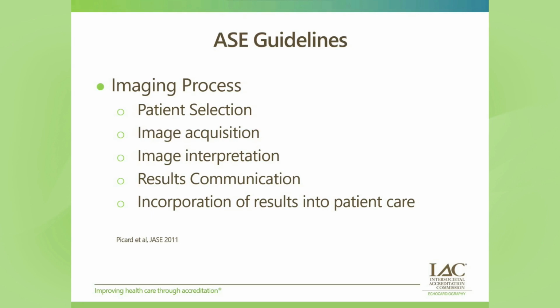Stat or urgent studies should be interpreted and communicated immediately. Routine studies should be interpreted within 1 business day. So each Echo Lab should have a policy for reporting critical values and a method to communicate these findings. Echocardiographers may aim to develop and implement strategies to educate their referring providers about what an echo can and cannot measure, when to use it, and what findings mean for both diagnostic and therapeutic decision-making.